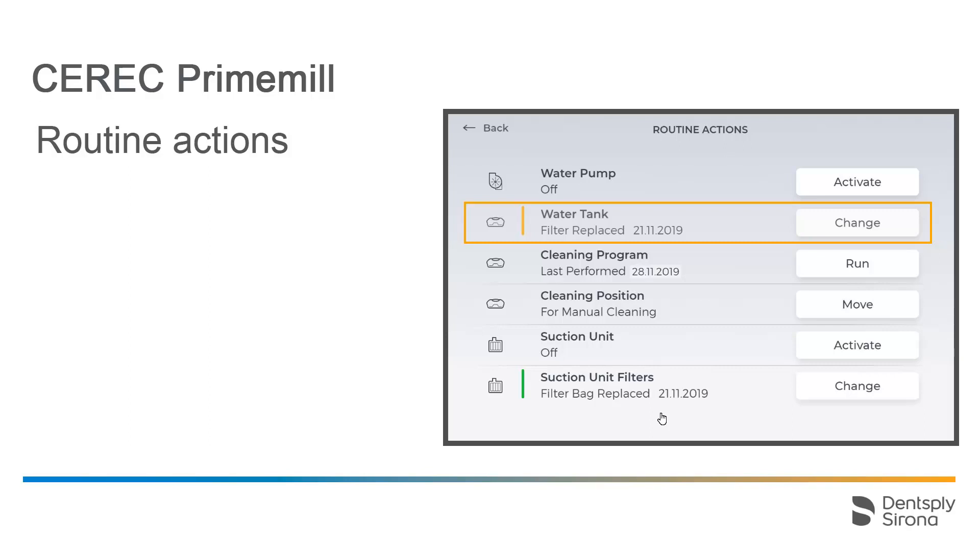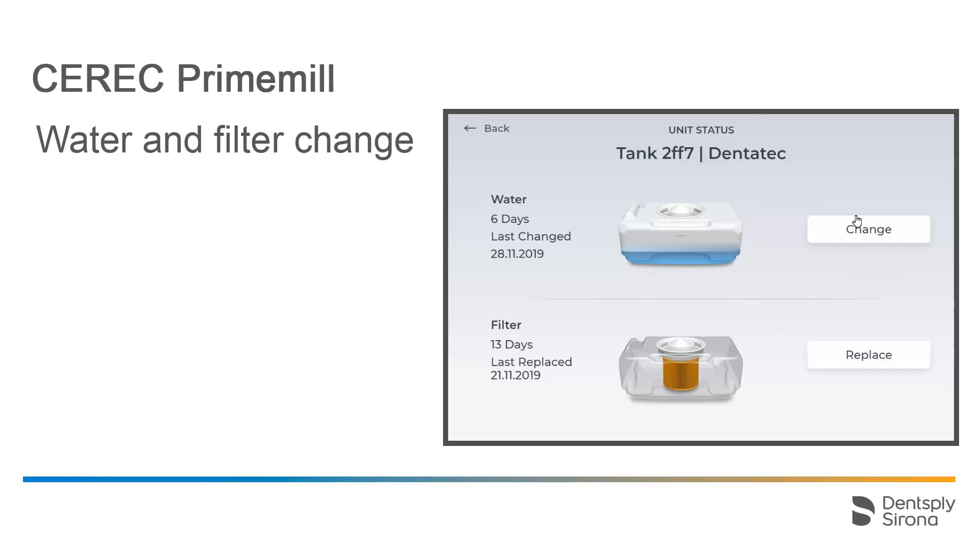Next, we will take a closer look at the water tank and water filter change operation. To do this, we tap the Change button. To prevent poor quality during manufacturing processes, the water should be changed regularly, at the latest when the prompt to do so is displayed on the Touch interface.